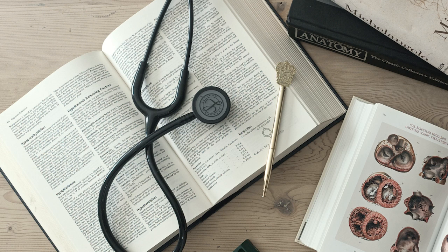Left bundle branch block, LBBB. What does that distinctive pattern look like on the ECG? What's happening physiologically? In left bundle branch block, there's a loss of conduction through the left bundle branch system. Physiologically, early depolarization then occurs via the right ventricle, starting from the right bundle branch, and the left ventricle depolarizes abnormally and slowly, primarily through slower cell-to-cell conduction, taking a longer circuitous route. Okay, slow path through the left ventricle.